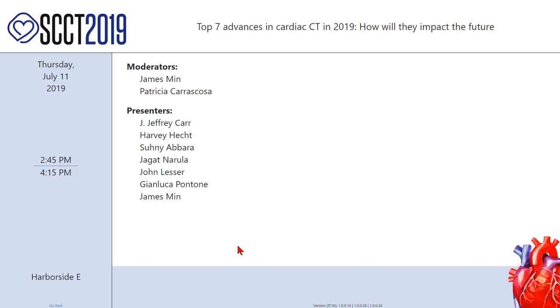Any other question? I would like to ask you something. When you work at your institution, do you reduce the contrast dose in all patients for all the CT angiography studies, and if you do so, how much is the reduction? So we actually, we're chickens, I think. We don't reduce it in most patients. For most patients, we do nothing. We already are a low-dose site. We only minimize the dose in patients with renal failure or other renal concerns.